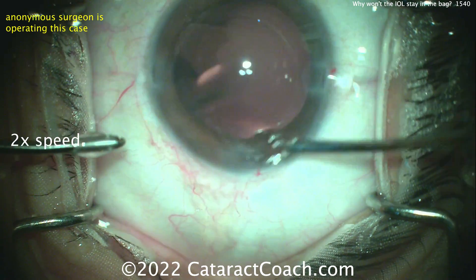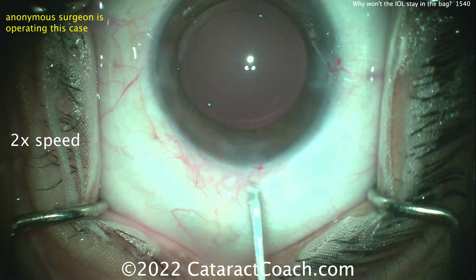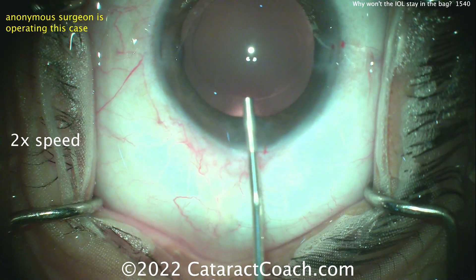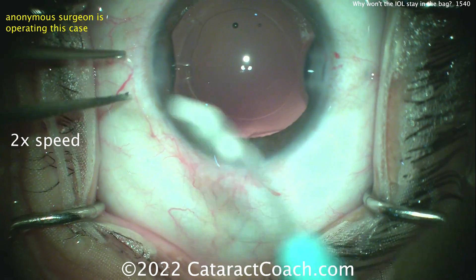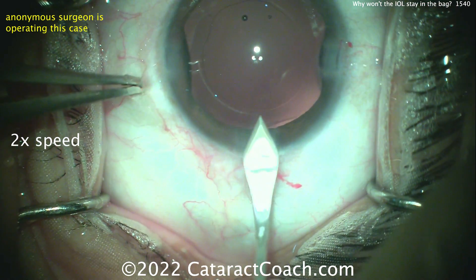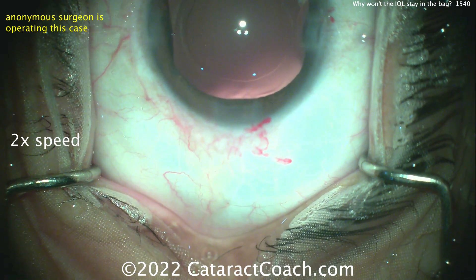Here's the end of the case — the capsular bag is totally empty. Hard to tell from a 2D video if there's any shallowing or flattening of the bag, but putting in some viscoelastic. And now widening the incision just a bit more.